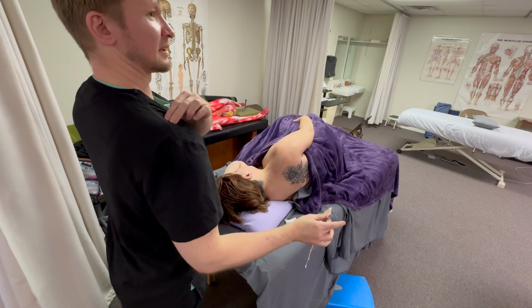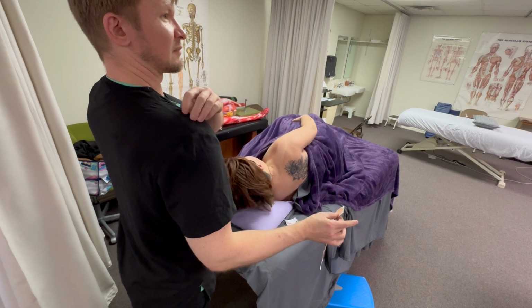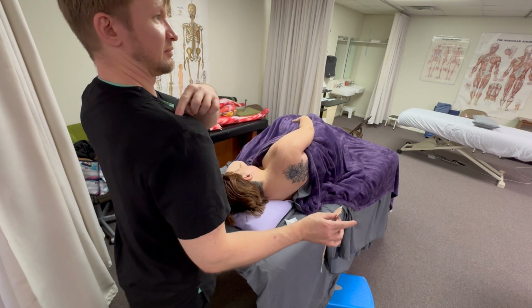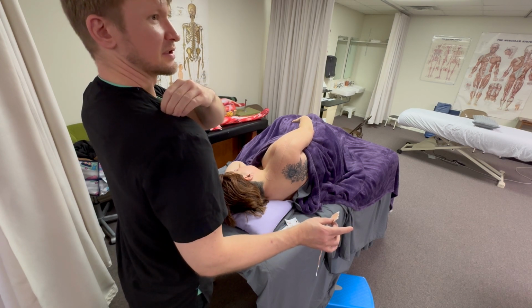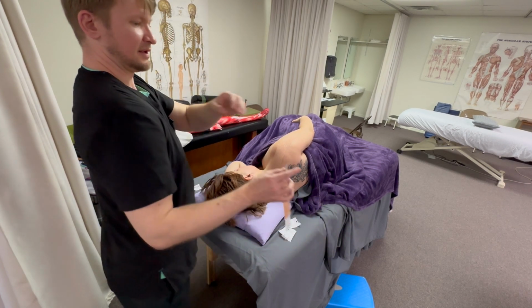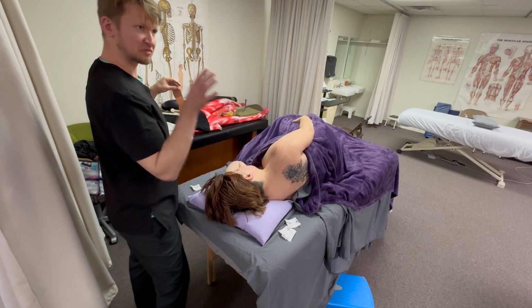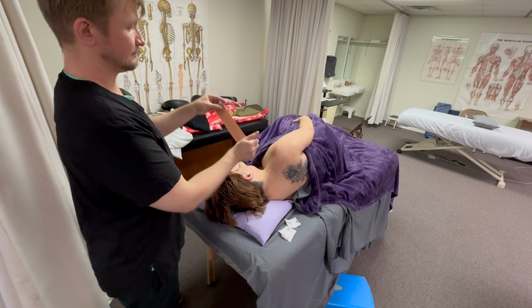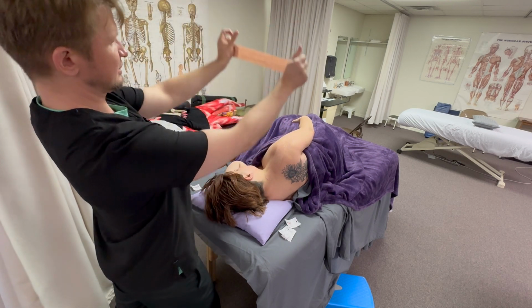Right here is mine. I can find the acromion, and then I start going towards my neck until I find a bump where the clavicle is, and there's a little nook, a little dip right there. So I want to give that joint some support. So here, 50% and more.